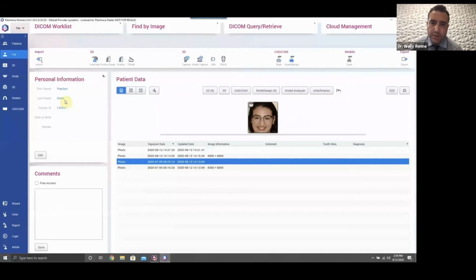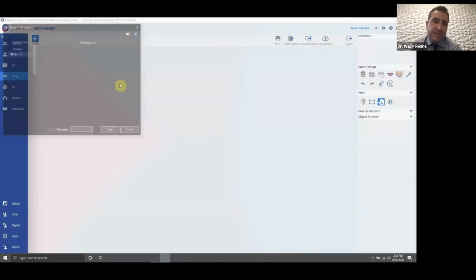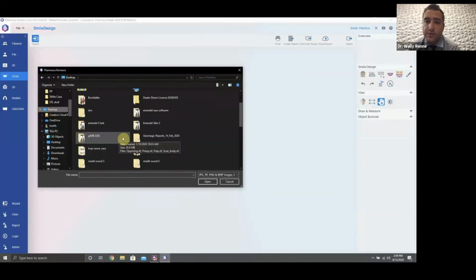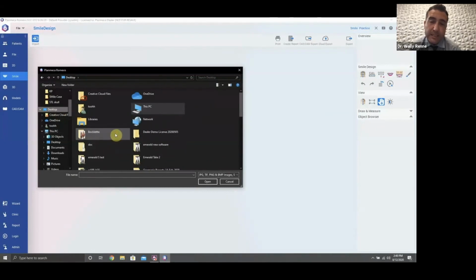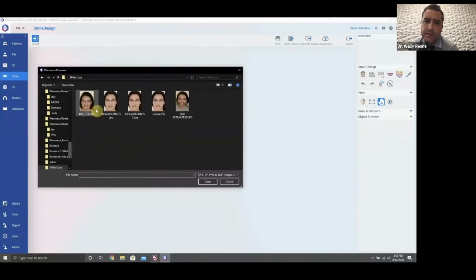And so now I'm going to show you how to do it. We're going to go through this software probably at a greater detail than you would ever want to know. I'm going to load up a patient, and we're just going to go to town. This would be as if the patient's coming to you for a consultation. You're going to make three photographs: repose, smile, high E smile, and retracted smile, with retractors. And we're going to show you what to do with these photographs and how we use them to diagnose the patient. So here we go.